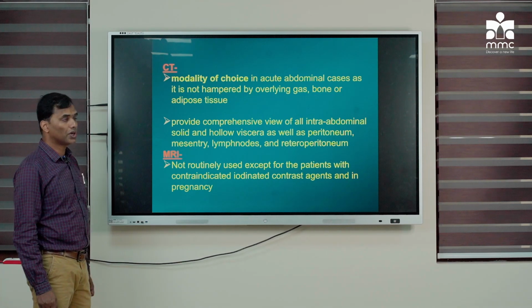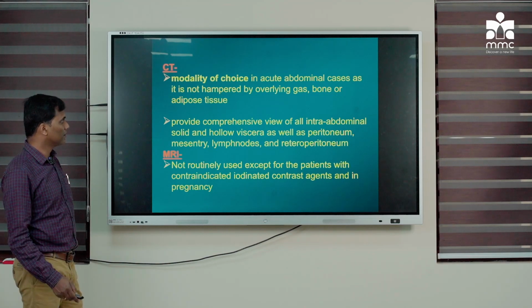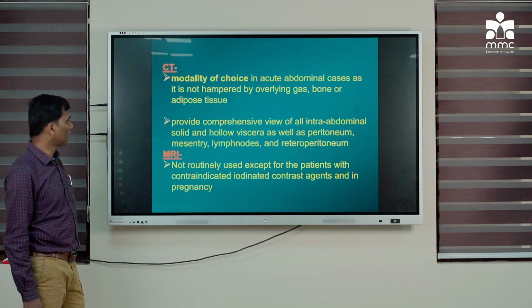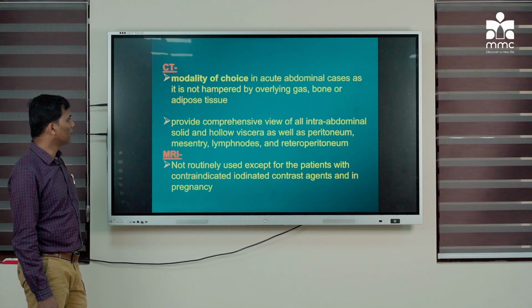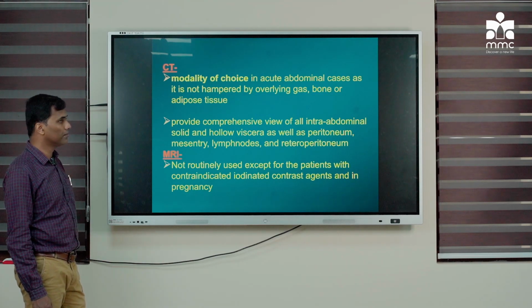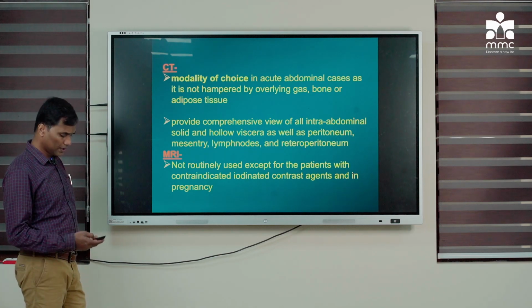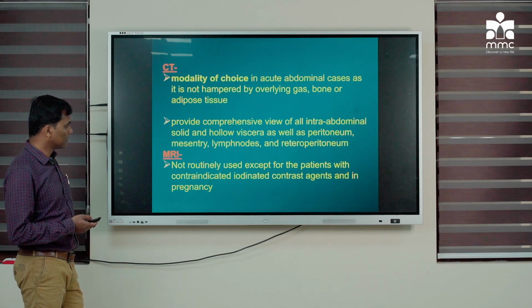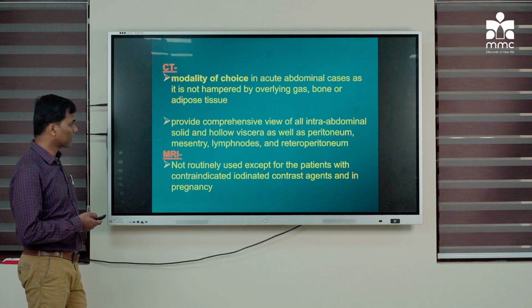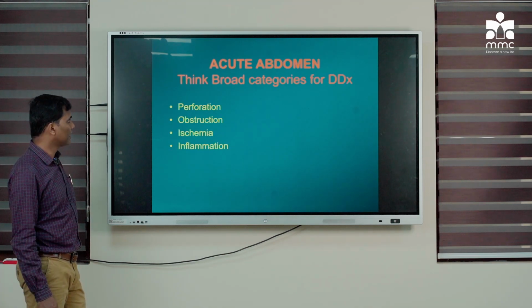CT is the modality of choice for acute abdominal cases, as it is not hampered by any bowel gas, or bone or adipose tissue, which is a limitation for ultrasound. It gives a comprehensive view of all intra-abdominal solid and hollow viscera as well as peritoneum, mesentery, lymph nodes, retroperitoneum, etc. MRI is not usually used, except if there is a contraindication for iodinated contrast medium, and also in pregnancy where radiation is to be avoided. MRI doesn't have any radiation.